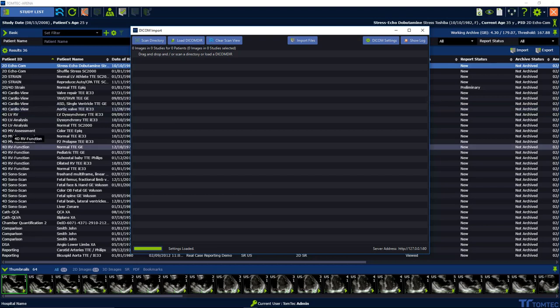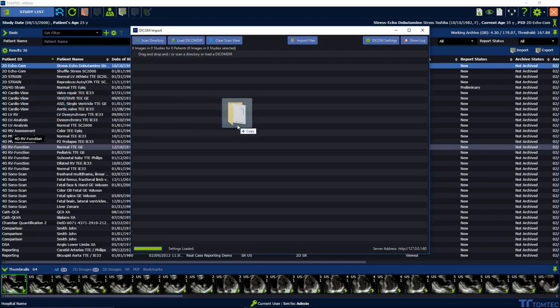You can now import studies in three different ways. Drag and drop easily from your local archive.